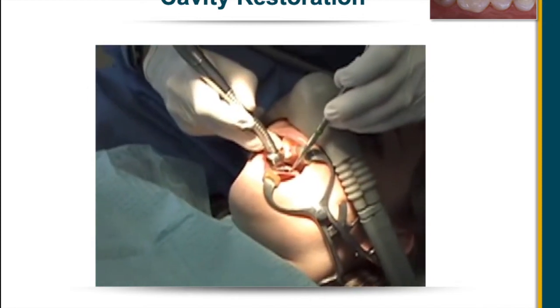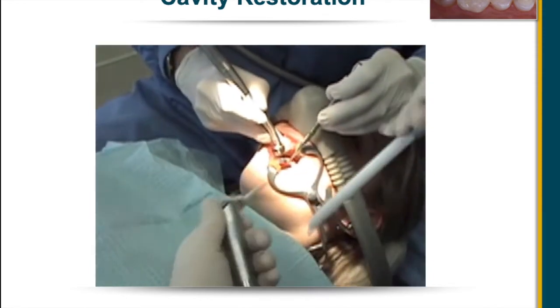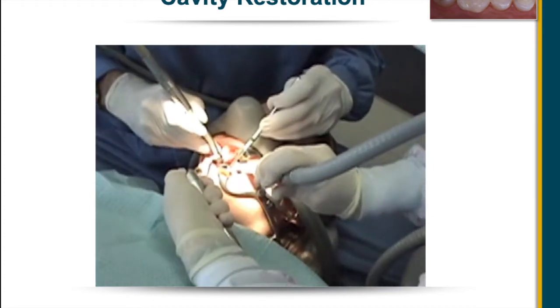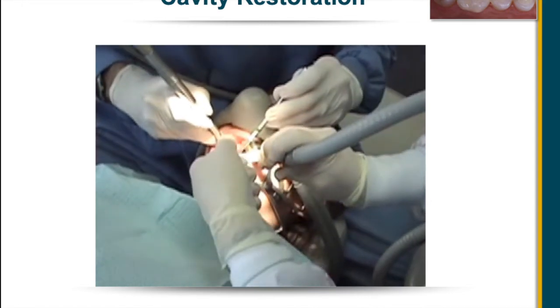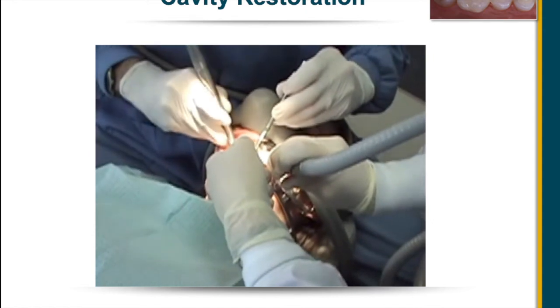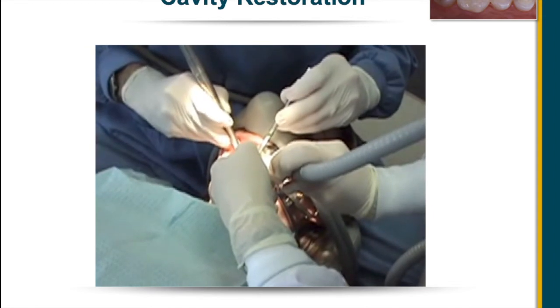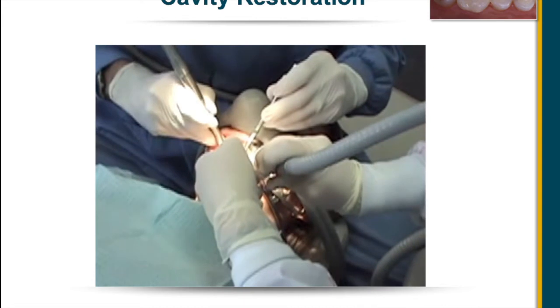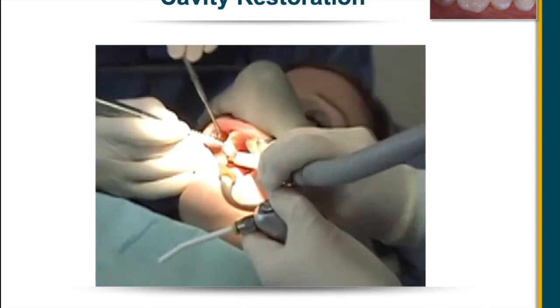The doctor now uses the high-speed handpiece to shape. Typically, this is not done with air-water, although the preference of the doctor may be to use water during the finishing steps. Notice the way the assistant is holding the high-volume suction, and the positioning is generally the same as for the preparation. Air over the mirror and high-volume suction to eliminate any water or dust that may be coming off.